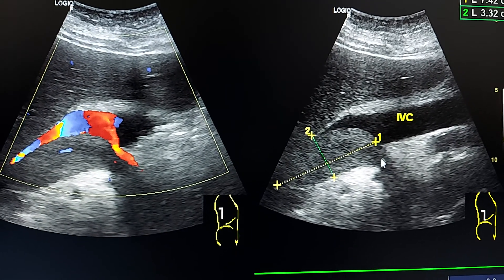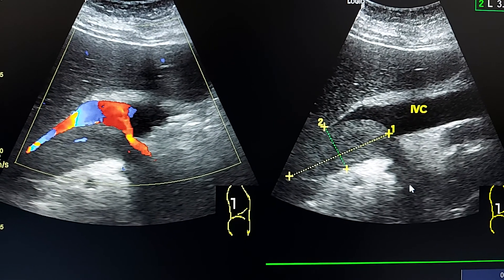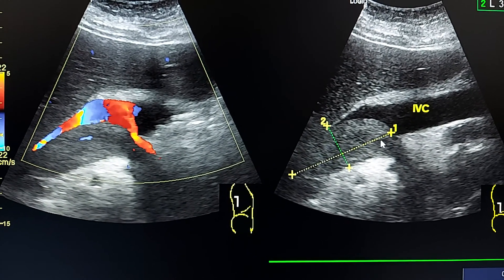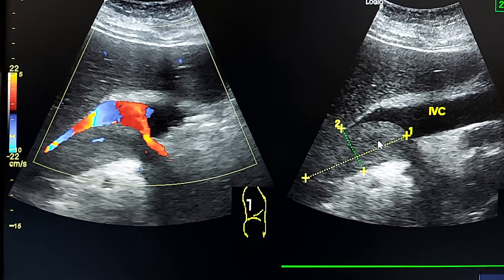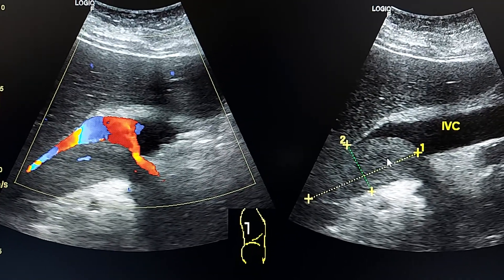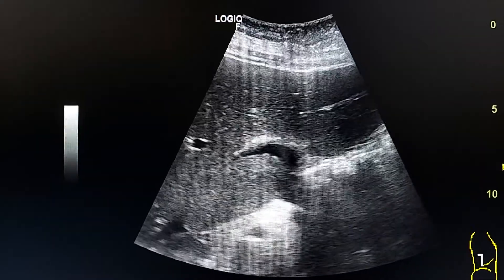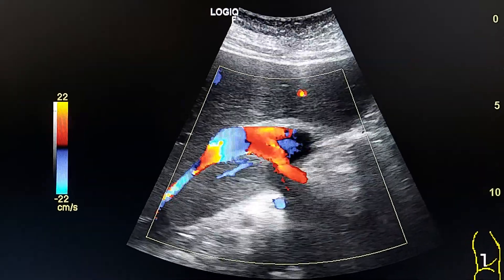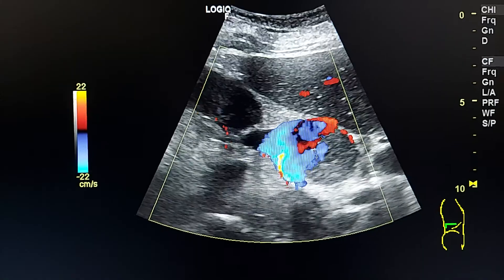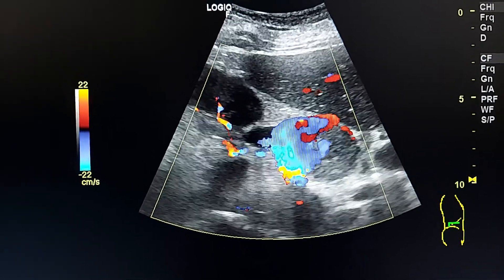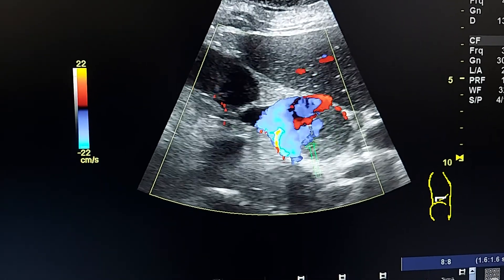This is the site where the left renal vein enters the IVC. The lesion continues into the left renal vein. It may be a thrombus and it may be a tumor thrombus — it has distinct margins. On color Doppler, this is an axial view of the area where we see this mass.